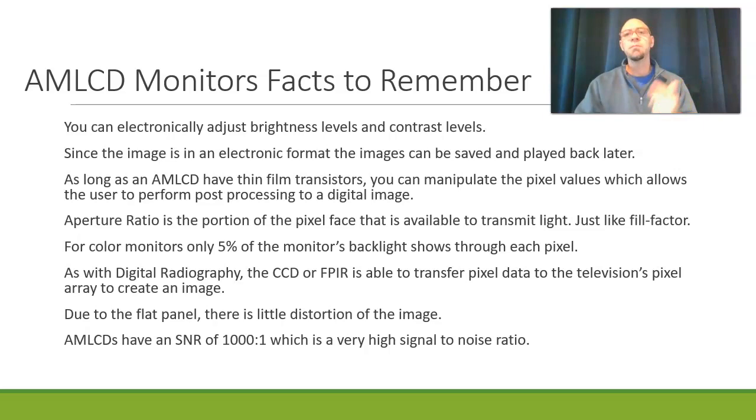Now, this is most important when we're dealing with interventional radiology, where we use things like subtraction, and different things like inversion. The blacks become whites and the whites become blacks. And so we're able to do that, not so much with regular diagnostic fluoroscopy. But all of this is possible because the image ends up being a digital image, and we can manipulate all of those pixels just by playing with the data.